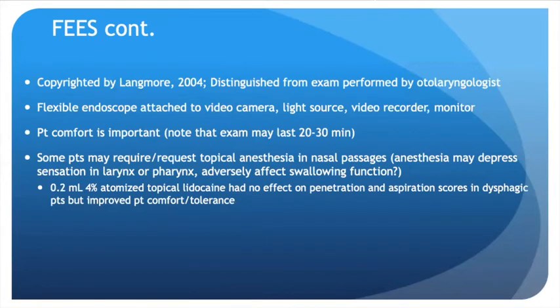So more on the FEES. The FEES exam was copyrighted by Langmore, and this is different from the exam performed by otolaryngologists. So otolaryngologists are looking at providing a medical diagnosis. Like I said, we are looking at describing function. So all of our language in our diagnosis and our report will be geared towards assessing function. The FEES requires a flexible endoscope, a video camera, a light source, a video recorder, and a monitor. Patient comfort is very important during the evaluation.